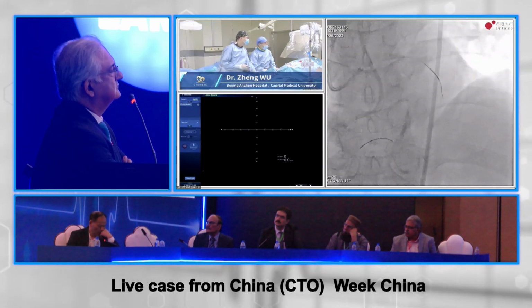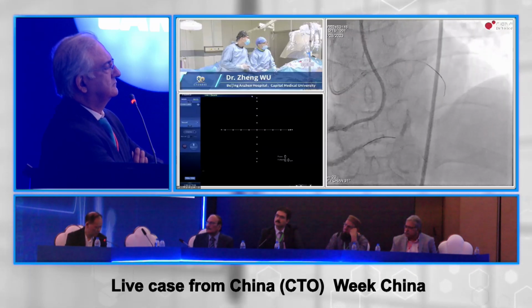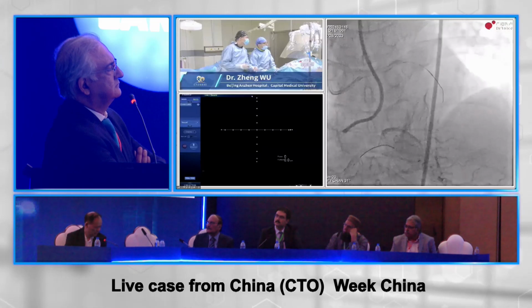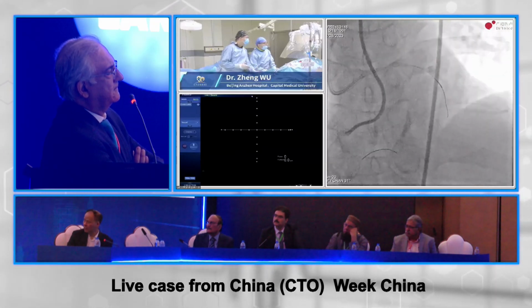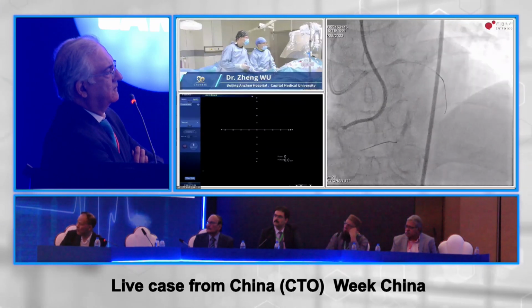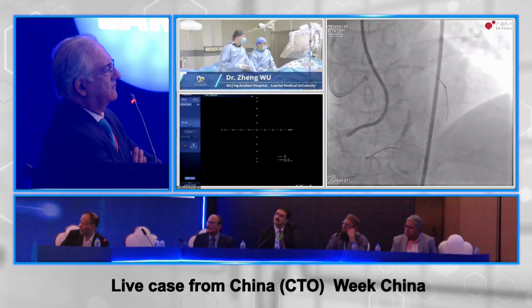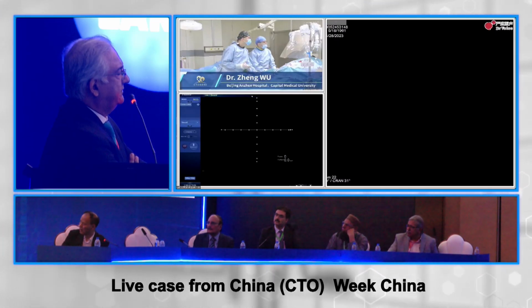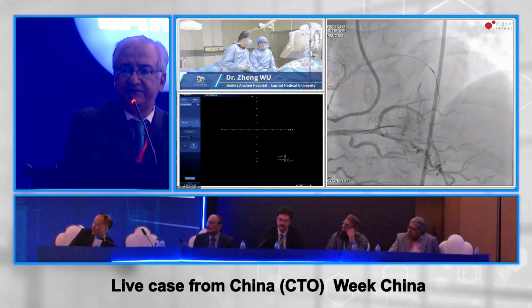If you fail, you wouldn't switch to Gaia second or third? You without the first wire is this, Dr. Wu? Also, we can perform the parallel wire. Dr. Salman, any comments? To find the right way.